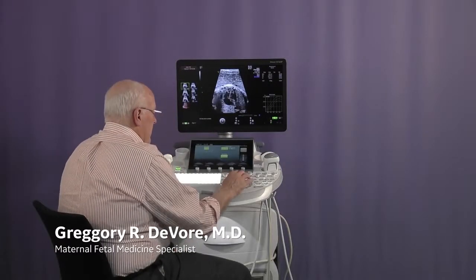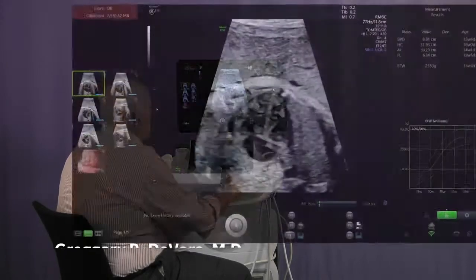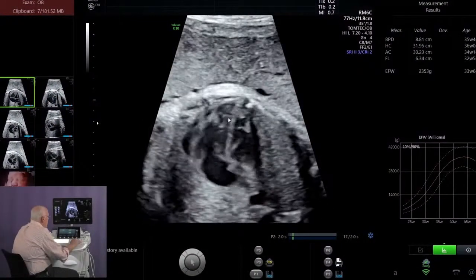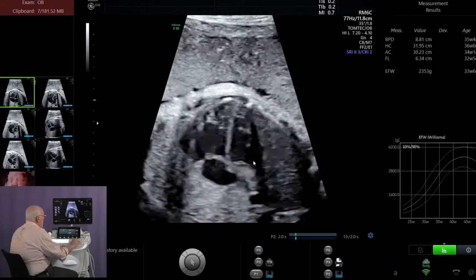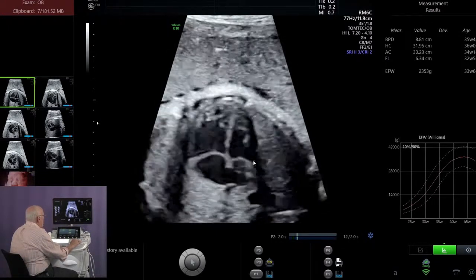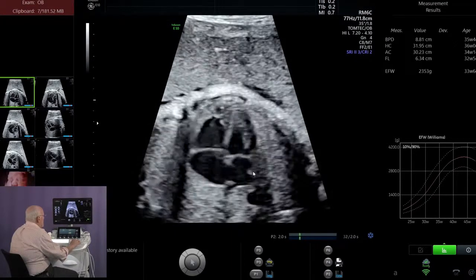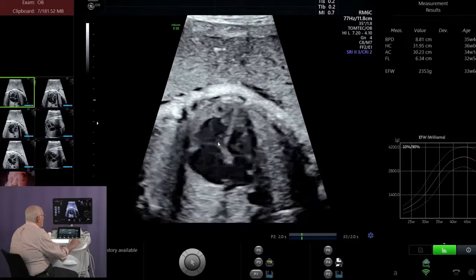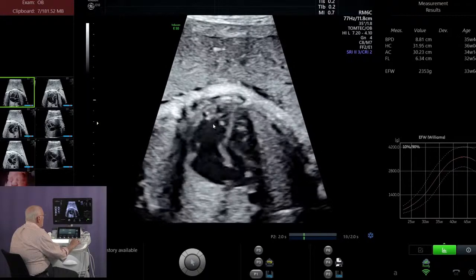Okay, this is a four-chamber view acquisition in which the apex is around 12 o'clock. And what I want to point out is, while this is the orientation used for TAPSE and MAPSE with an M mode, or with tissue Doppler analysis for looking at the base of the heart, it's not ideal necessarily for our fetal HQ. The reason for that is, while you can see the lateral wall of the right ventricle here nicely, the septal wall drops out.